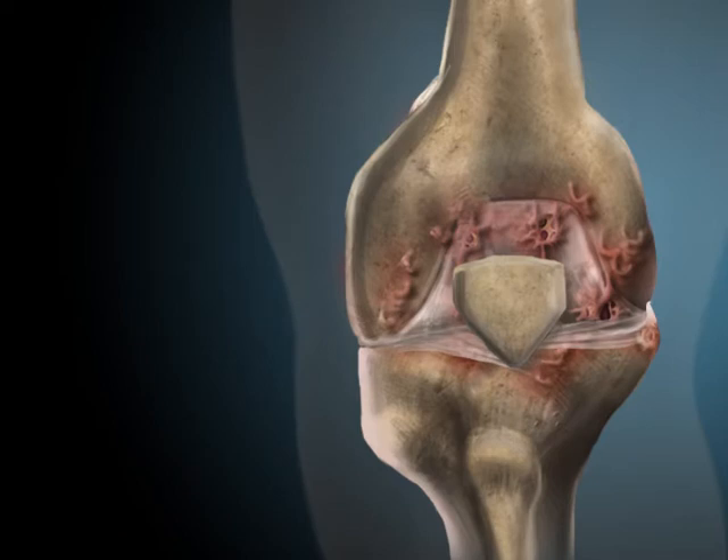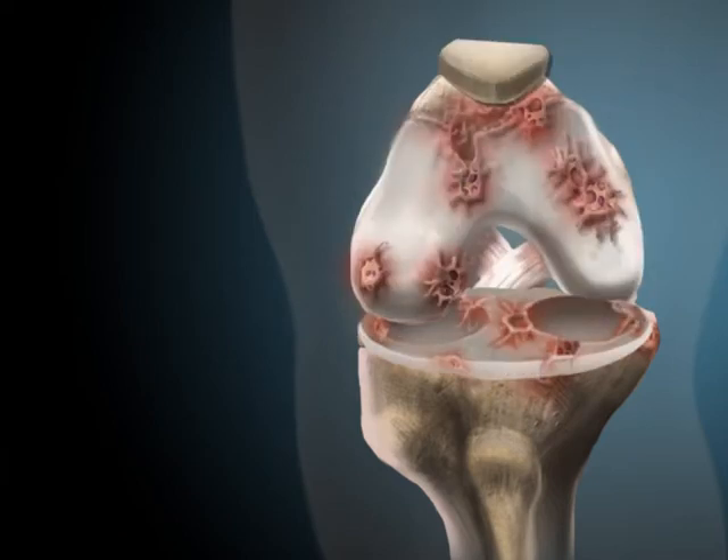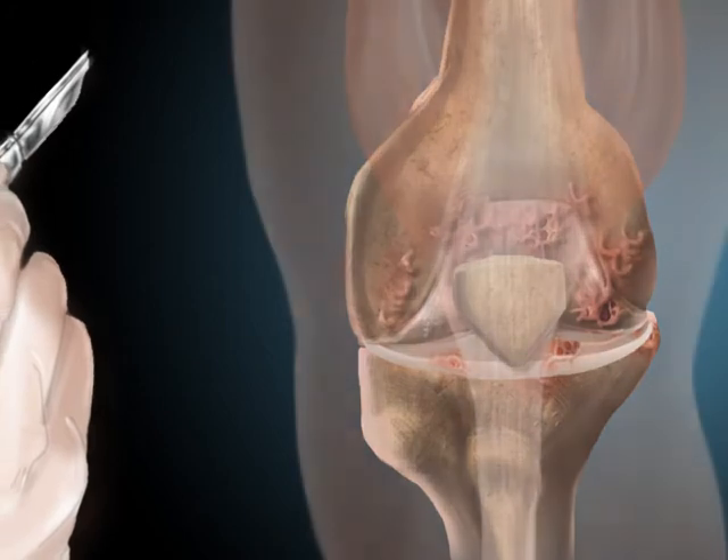Osteoarthritis is one of the leading causes of having the articular cartilage wear away and the number one cause of knee disability.